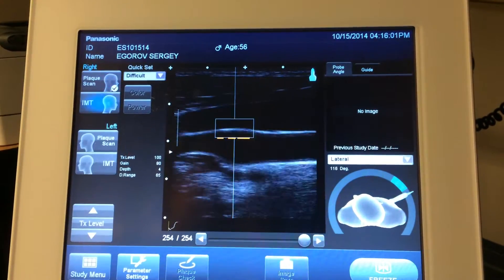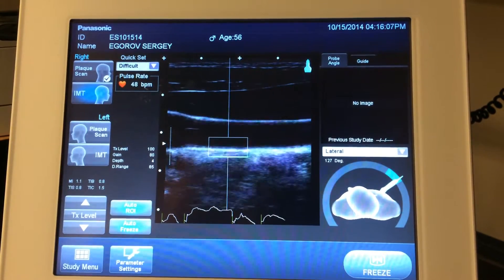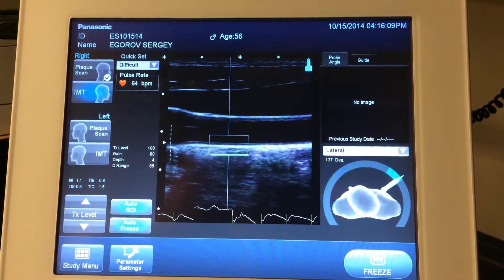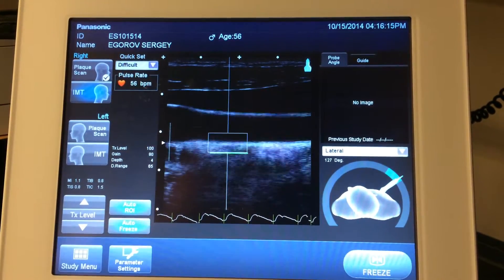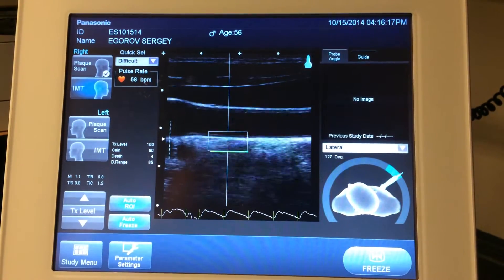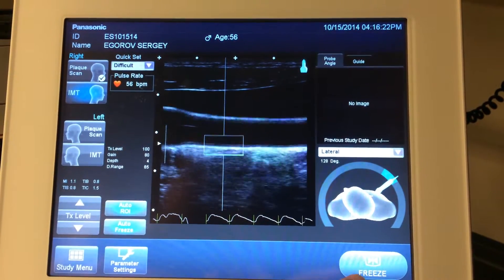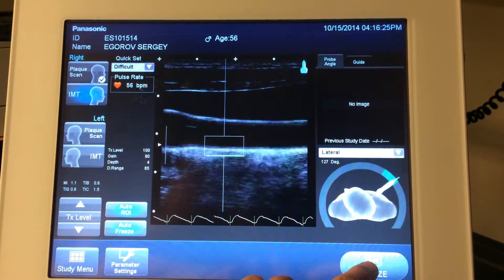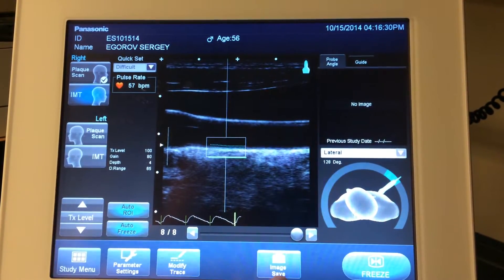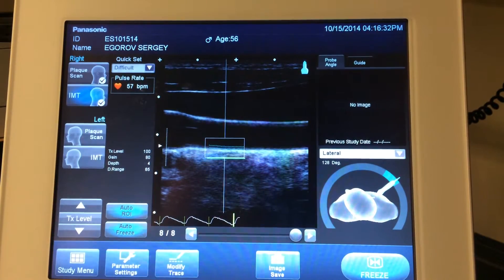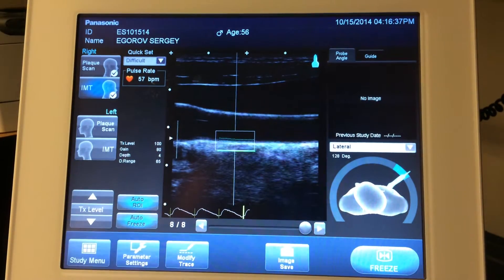And then the other thing that we do is we measure the thickness of the artery wall. So we're just going to move back a little ways here and let the machine get a reading on that for us. Your artery is moving quite a bit, so it's having a little trouble. So I'm just going to try to freeze it. There we go — now we got our reading. We're going to save that. And once we're done, I'll show you the report. We'll see how your thickness compares to your age group.